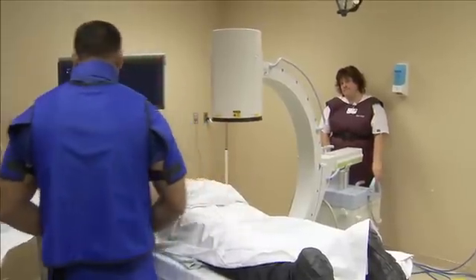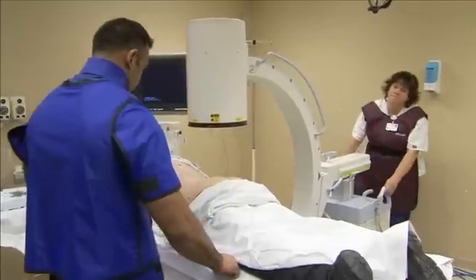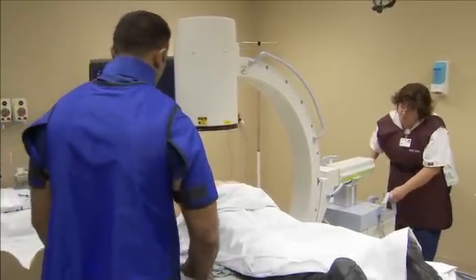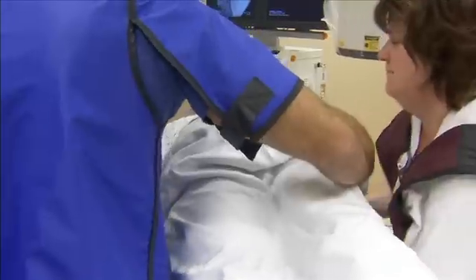During the intra-articular SI joint injection procedure, a C-arm is used to identify the inferior portion of the SI joint with the patient in the prone position. Some physicians place a pillow under the abdomen at the level of the iliac crests.